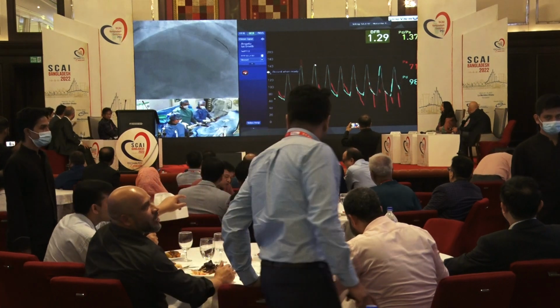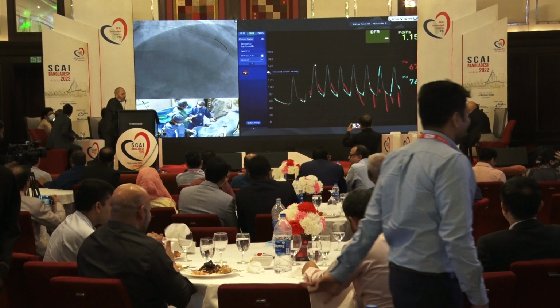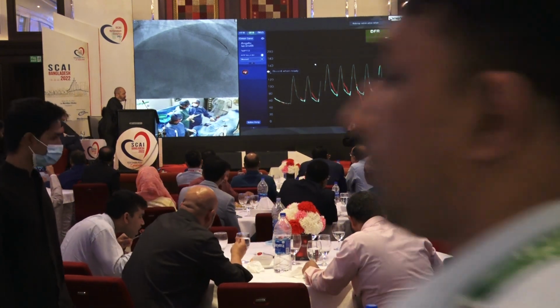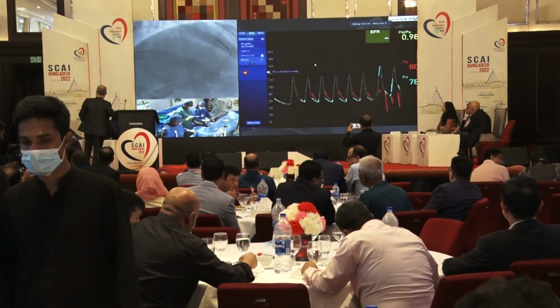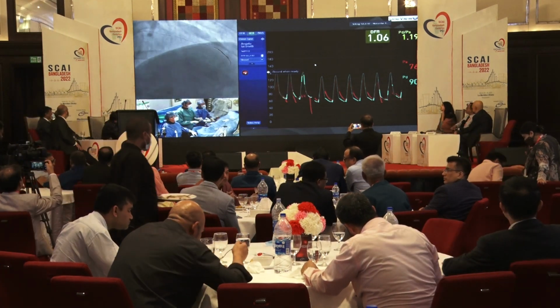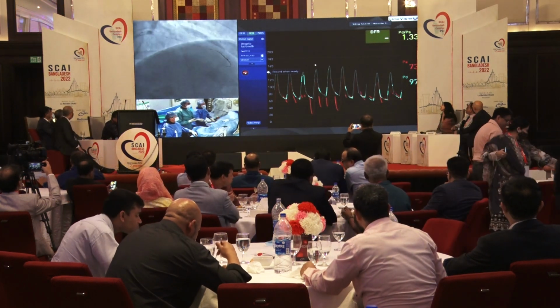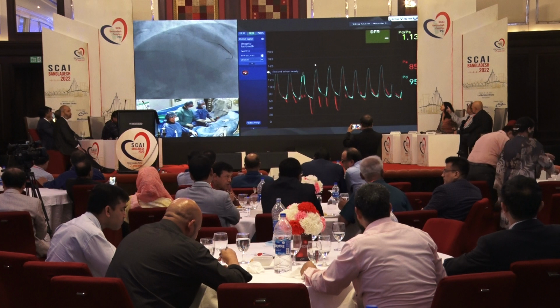I didn't know that we have a 40 mm balloon. It's the first time. They're brand new. We have only up to 30. Which company? These are Terumo, the new semi-compliant balloon that has a super good crossing profile. Can you test it in the picture?